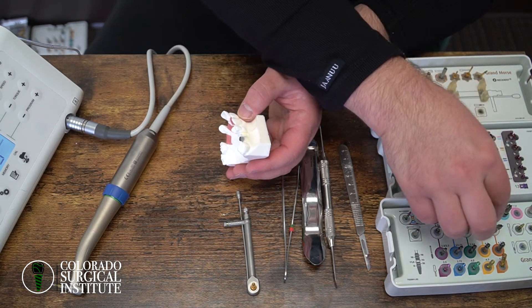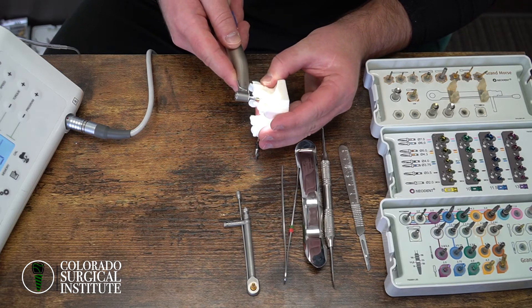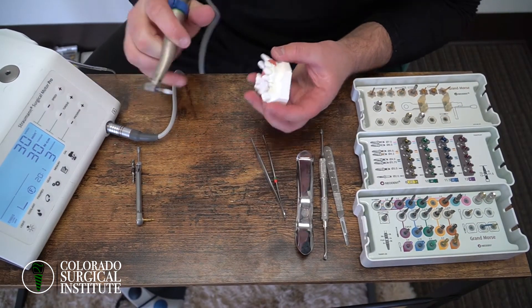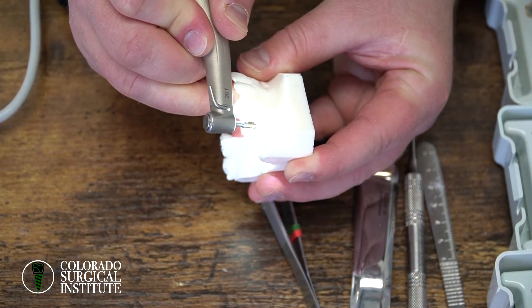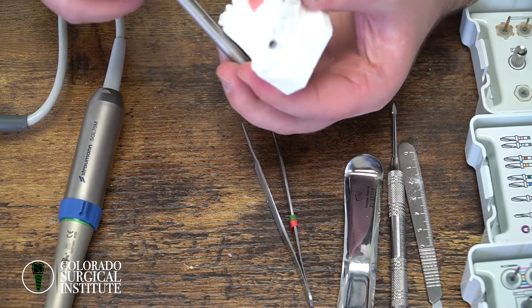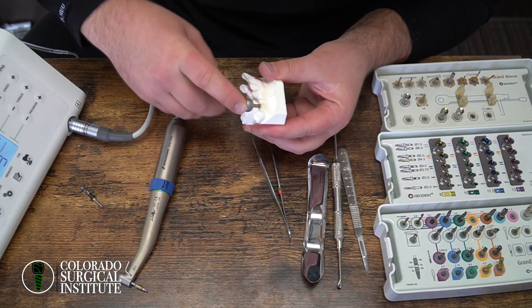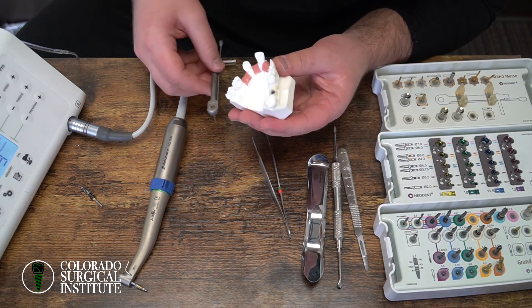Sometimes in super thick bone you may actually have to go wider. When you put the implant back in, it should go to depth. You want it to stop about one to two millimeters above the osteotomy — at that point you just pick up your torque wrench and finish it off. Press down with one hand while torquing with the other. Remember, the little lines on the implant — you want those lines to go about one millimeter below the bone. Always.